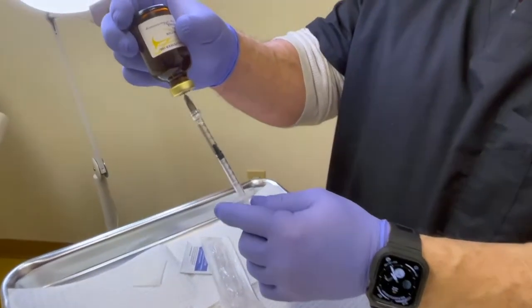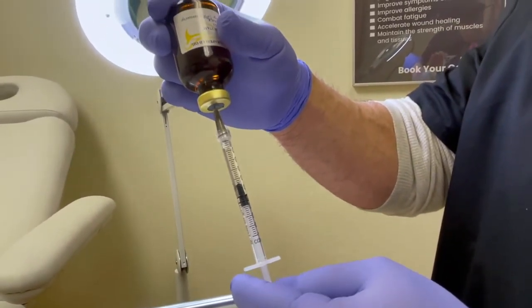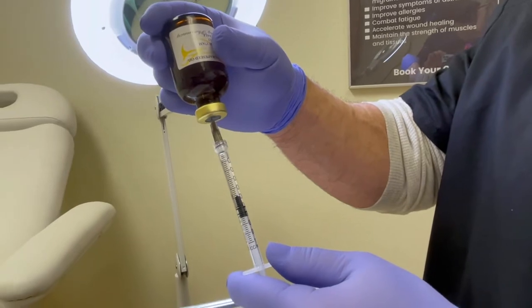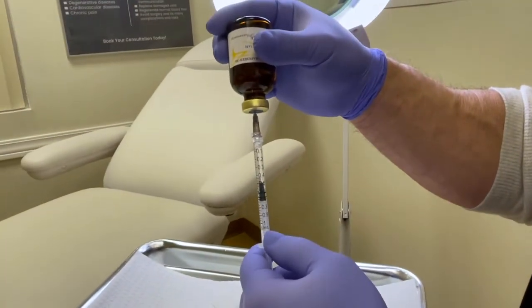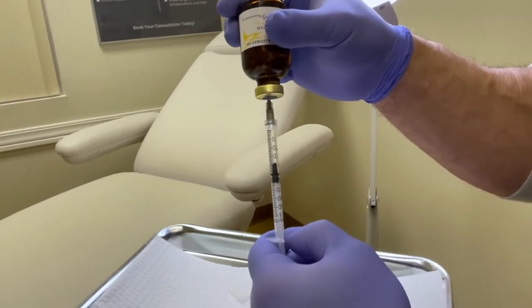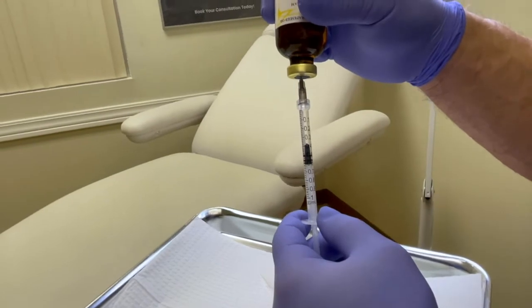For a testosterone dose of 100 milligrams at this concentration, that's 0.5ml. I pull past 0.5 a little bit, then plunge out any additional air until I have the exact dosage I need. As you can see, I'm right at 0.5.